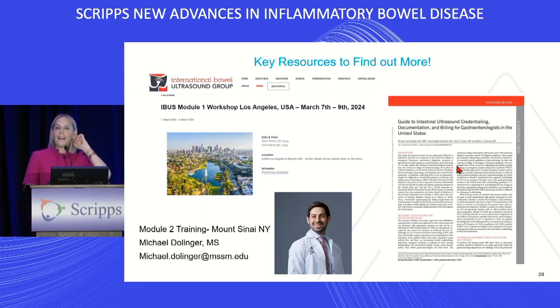The biggest question I get asked is, can I bill for it? How many RVUs? Do you make money? That's everybody's question, and guess what? All 3 are positive. You make RVUs, and if you do it in a hospital setting, there's a facility fee. Millie, I don't know if you do it in an ambulatory or Article 28 space, but the facility fee is quite good. It's 1 RVU for just the ultrasound, then you add almost another RVU for Doppler. So you're getting almost as much as a capsule read or a colonoscopy, whatever the RVU is. It's not that far off, so don't let anyone tell you otherwise. If you really want to know, we wrote a Bible that was published in the American Journal of Gastroenterology that tells you how to set it up, how to bill, how to make money.